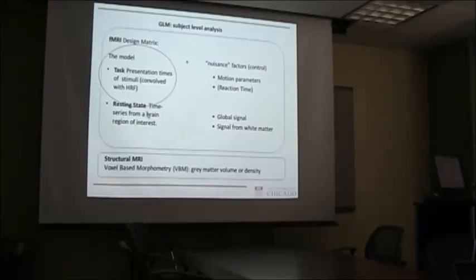And also, we're not going to really talk about this too much, but you could do a similar thing if you want to, for example, analyze your resting state fMRI data, which has become really popular in fMRI research. And you could analyze your resting state data in a pretty similar way as your task fMRI, only your model would not be the onset of certain stimuli, but you would use the time series of some brain region of interest.